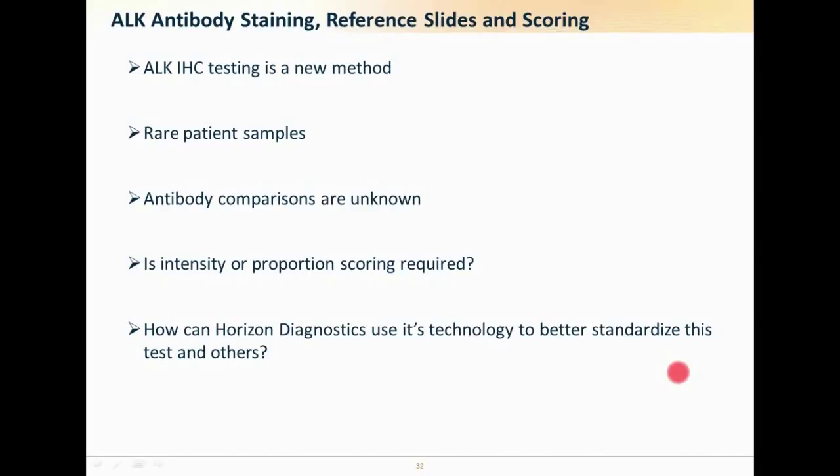So what we plan to do is get reference slides, look to identify low, medium, and high, and then we can start doing antibody comparisons.